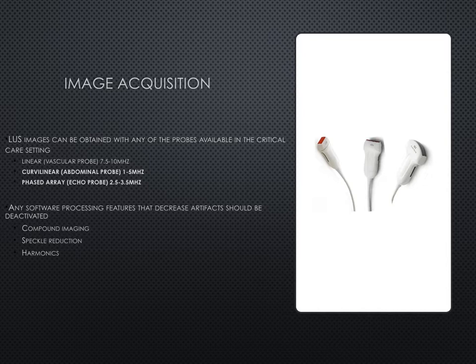The phased array we can use, but generally speaking, the phased array probe is used as an adjunct to the cardiac exam that you might be doing, as an additional imaging of the lung, and not necessarily your go-to probe that you would use to image the lung as a whole.